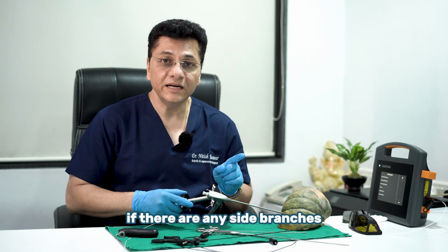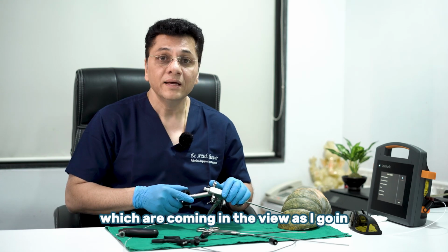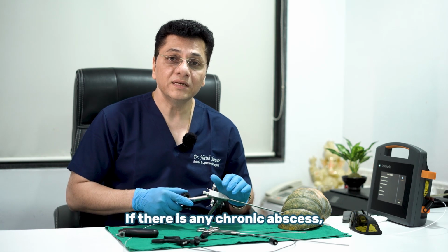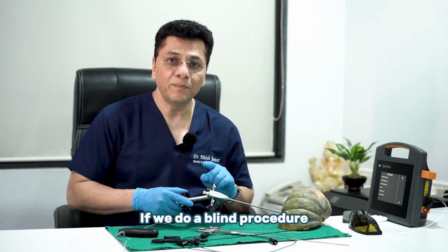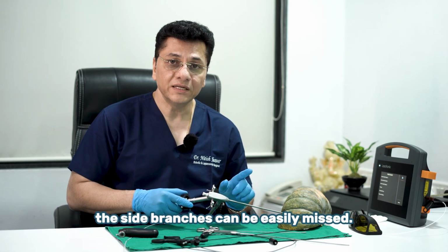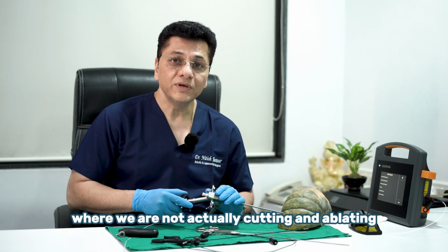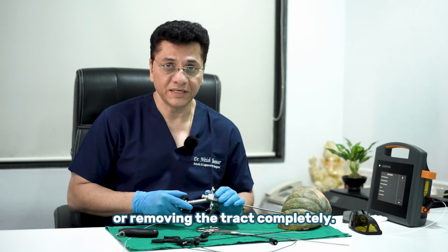If there are any side branches, we'll see those pouches coming into view as I go in, and I can tackle them when I'm doing the operative part of the VAAFT. If there is any chronic abscess, then we see a little wider cavity. If we do a blind procedure, these cavities can be easily missed. The side branches can be easily missed, especially when we are doing a sphincter saving procedure where we are not actually cutting and ablating or removing the tract completely.